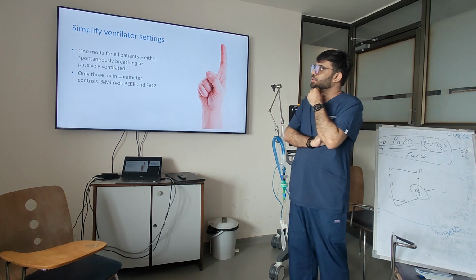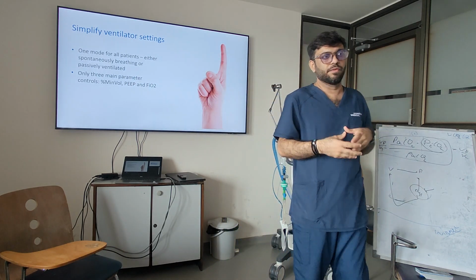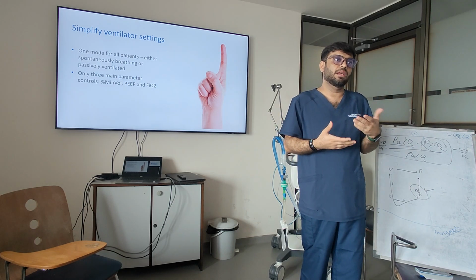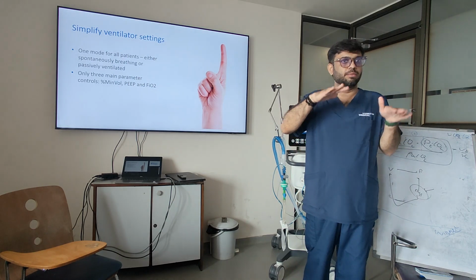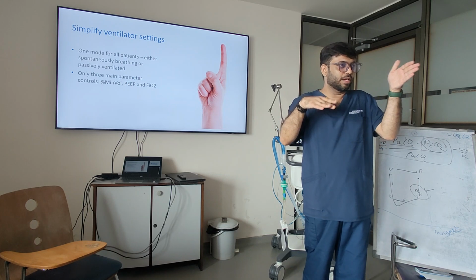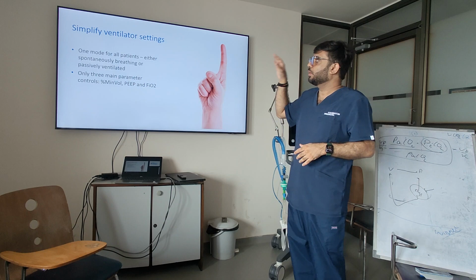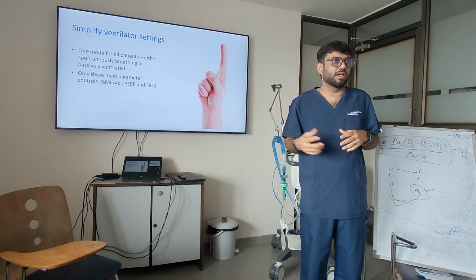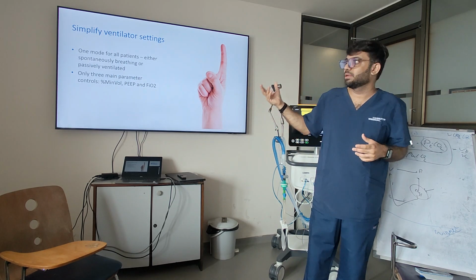Okay. So, as I said, it is one mode from intubation to extubation, which can be used for passive patients, of course, because when you intubate, the patient will be passive, and then eventually when the patient gets active or starts breathing spontaneously, the machine will auto switch from the passive to the active part, which I'll explain in a subsequent section. Now, in terms of parameters, we need to understand how it happens, what are the minimum parameters we set, and what are the important parameters which are helping us to do this.